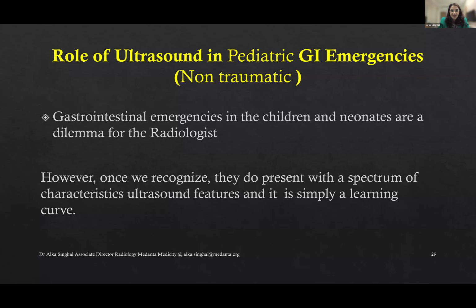These are the common things. And of course, post-transplant patients, hepatic artery thrombosis, you will see renal transplant failure, recent renal transplant patients or long-standing transplant patients, you can see thrombosis, arterial or venous, right? So the plethora is huge, right?